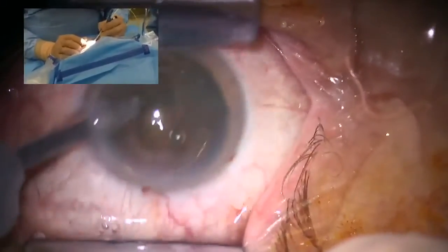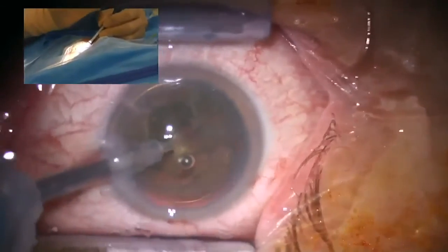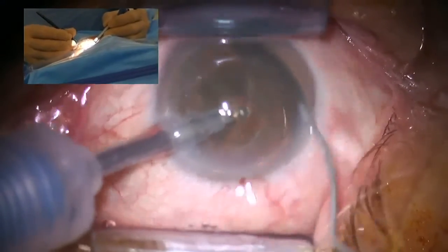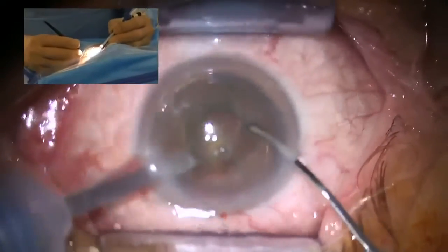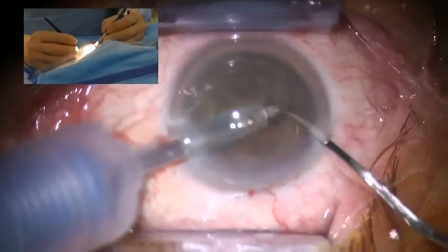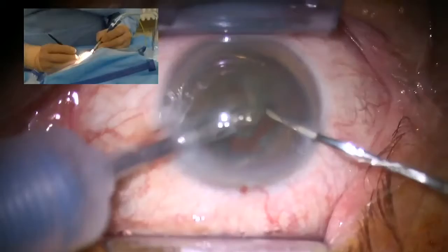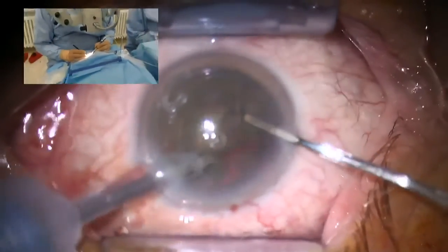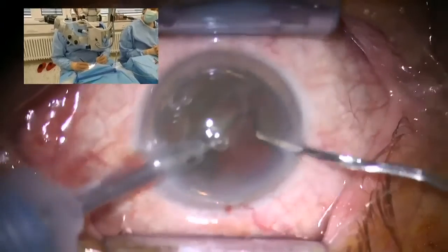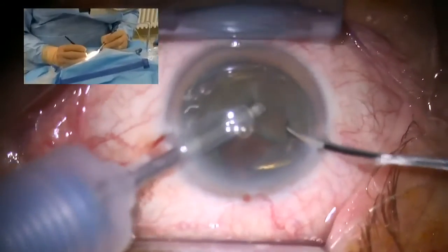So you hear the 8 hertz, and you can trigger. Sometimes it's slower, sometimes it's more speedy, and you do this by your foot pedal. So the use of the nanolaser is very self-explaining and very intuitive. You basically perform the surgery with the phaco machine you probably use, you are used to dealing with, but it triggers the laser.